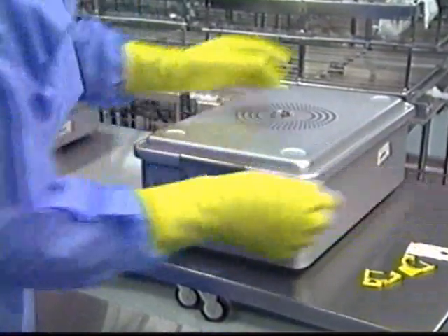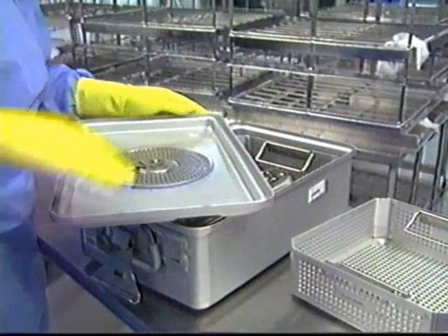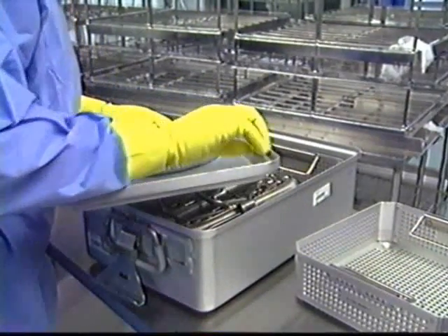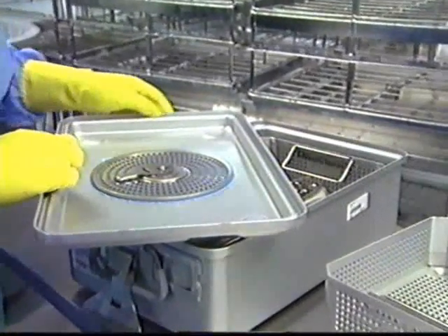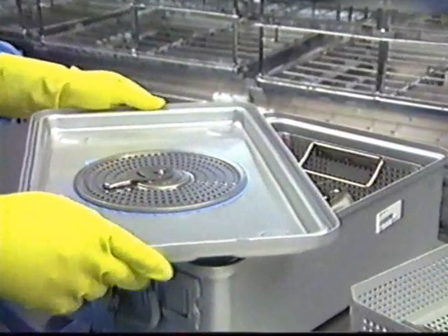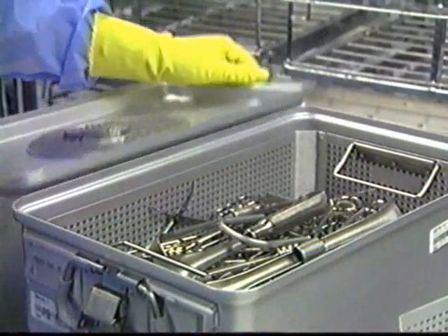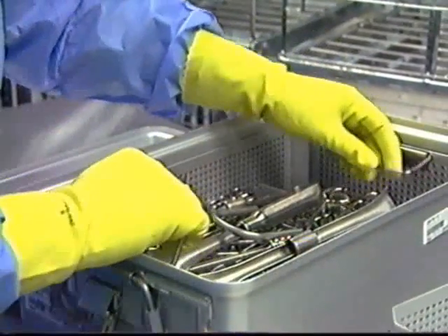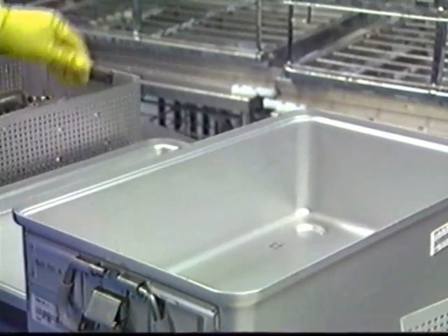Disassemble all components. Unlatch and remove the lid of the StereTite rigid container. Inspect the gasket in the lid for accurate fit and undamaged surface. There is no reason to remove the gasket for the cleaning procedure. Remove the tray of instruments and prepare the instruments for decontamination following the recommendations of the instrument manufacturer.